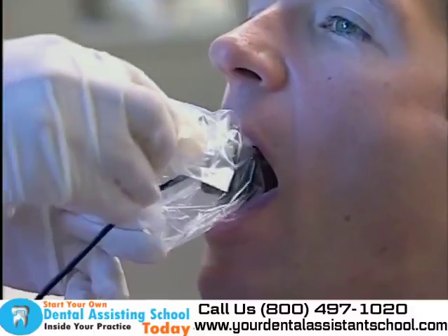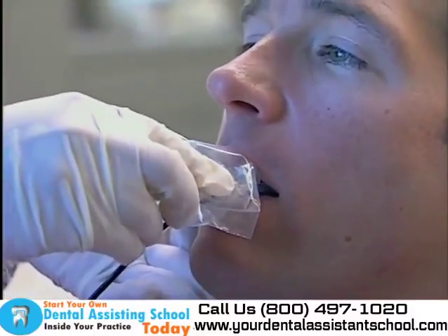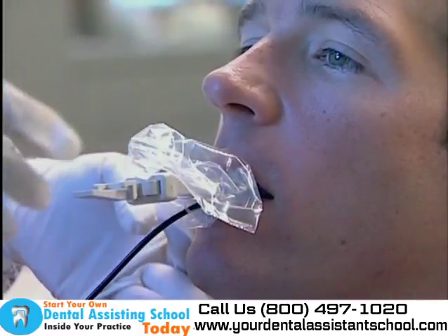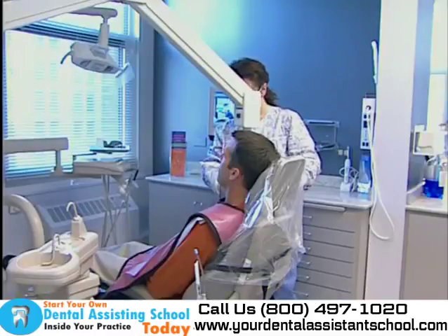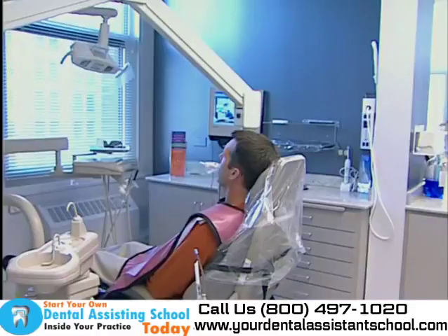The sensor that is placed in the patient's mouth comes in 2 to 3 sizes and is not flexible. The sensor should be covered with a plastic sleeve before placement intraorally and disinfected between patients. Sensors are fragile, and procedures for disinfection should be carried out according to the manufacturer's instructions.